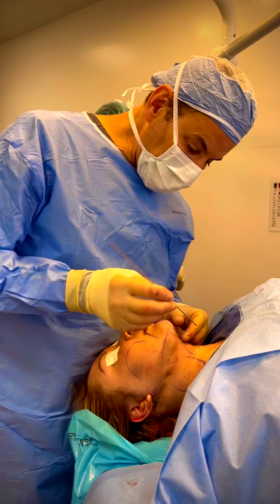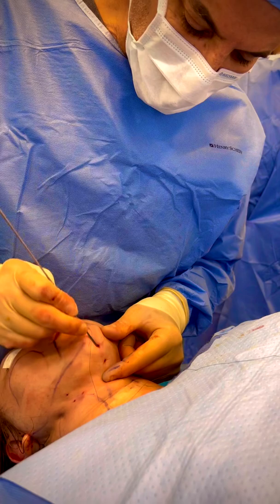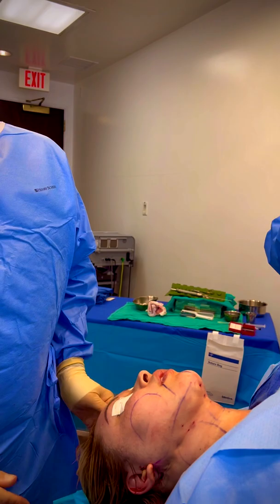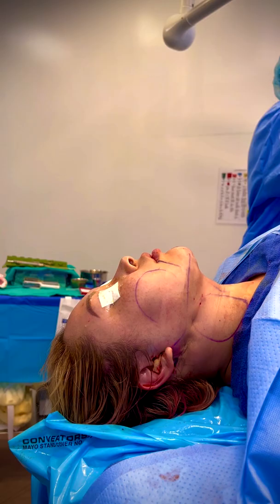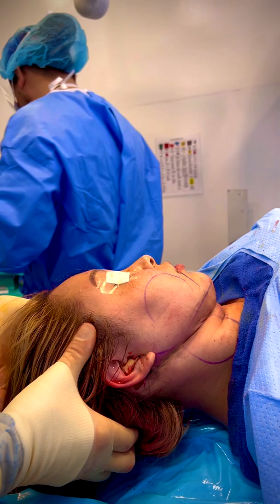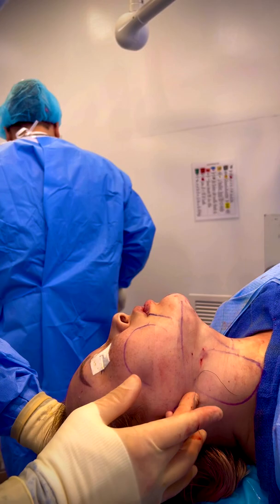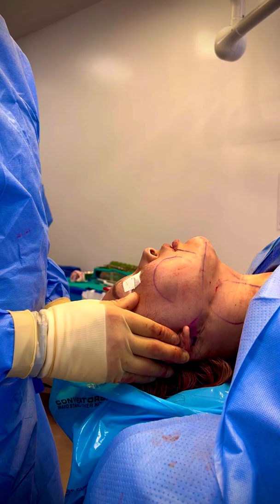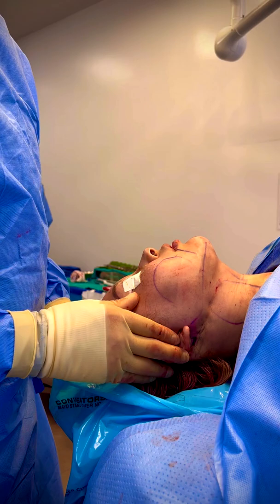We're going to tie it in a second and it's going to look just like that. The last step is we take the suture rod and push the knot deep in the space, then use it to sweep underneath the skin to make sure that permanent suture is right down on the muscle where we placed it. Now look at her profile and think of how she looked before — she just had the lipo and the Precision TX. You can see MyElevate is really giving her that snatched jawline, and if we lift her head up, you can see the difference — she's got this definition and support underneath the chin, just beautiful contours. In summary: Precision TX will take six months to a year to tighten the skin envelope; liposuction results are immediate; and MyElevate lifts the underlying foundation to really give the snatched jawline — a one-two-three punch to address every area of her jawline.